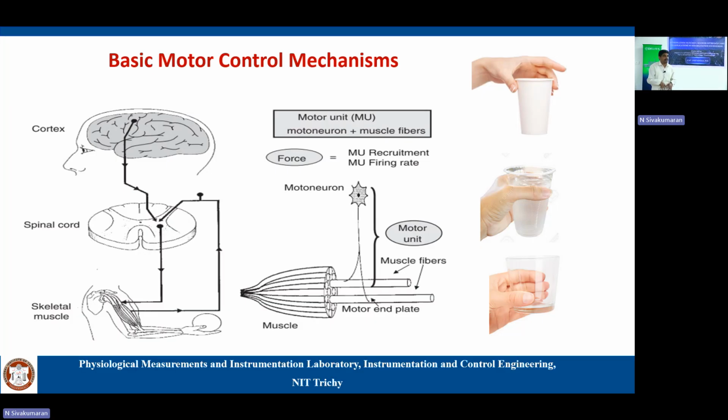Another important thing is that we have standards for EEG. EEG is a clinical tool, as I said, which you can see in hospitals. ECG is also a clinical tool. We have a standard protocol for electrode placement. But as far as EMG is concerned, we don't have any standards. Yes, we have some standards, but do we have standards for all the 600 plus muscles? The answer is no.